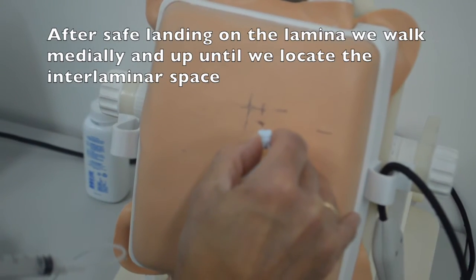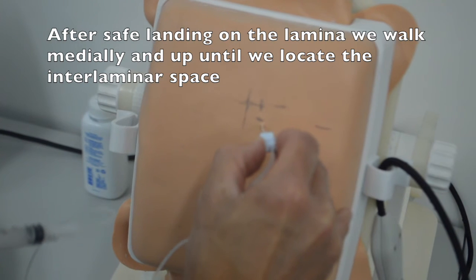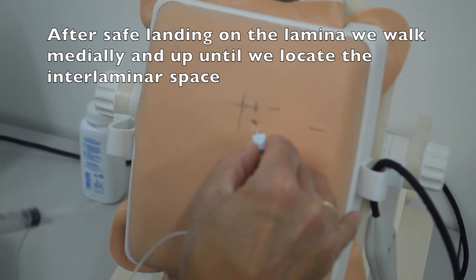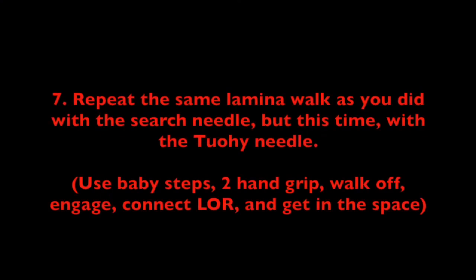After safe landing on the lamina, walk medially and up until you locate the interlaminar space. Step 7: Repeat the same lamina walk as you did with the search needle, but this time with the Tuohy needle. Use baby steps, two-hand grip, walk off, engage, connect loss of resistance, and get into the space.